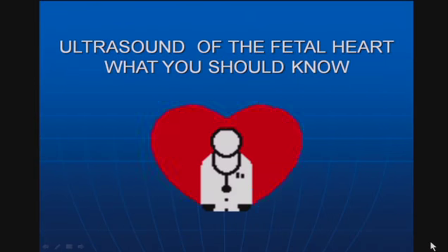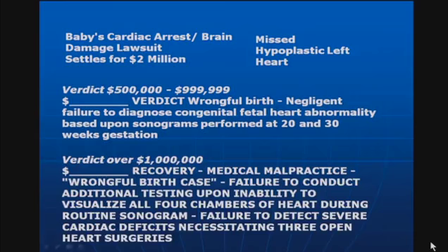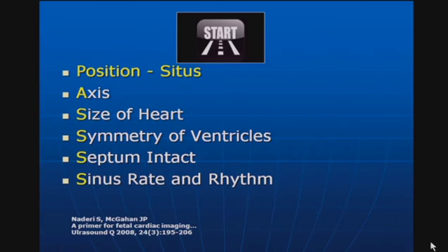Part of this is obviously we all want to do a better job in examination of the fetal heart so we really don't miss anything. But probably a secondary motivation, certainly within the United States, is there's a number of lawsuits that have been brought up against those performing obstetrical ultrasound. Many of these just have to do with missed defects. Verdicts are very high in these, $1 million, $2 million and higher, and they end up for a variety of causes, most of which are anomalies that could probably be detected on a four-chamber view of the heart.